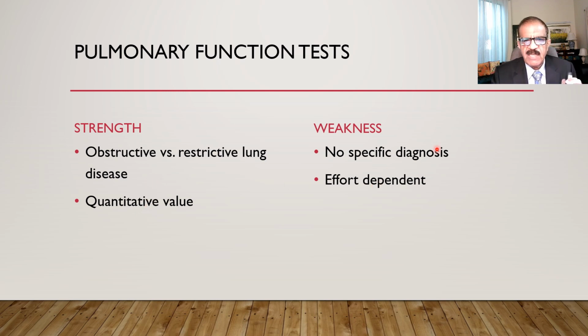But the weaknesses are, number one, it does not give you a specific diagnosis. You have to interpret these tests in the proper clinical context to have some meaning. So this is a limitation, and it is effort dependent and technique dependent.